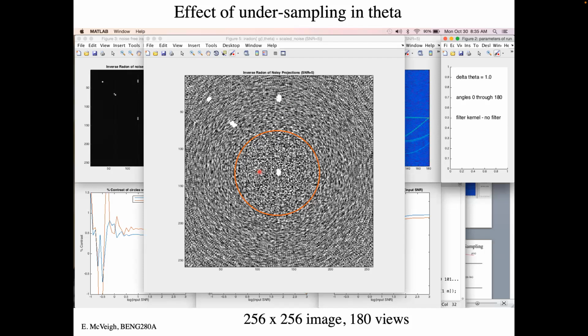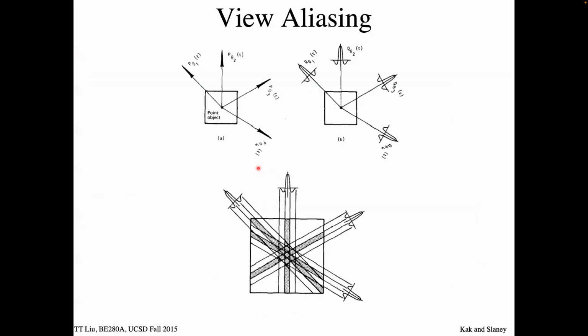And so we zoom that up and say, okay, well, what's inside this disk? Why does this look different than the stuff out here, right, in this mode of reconstruction? So this is called view aliasing.